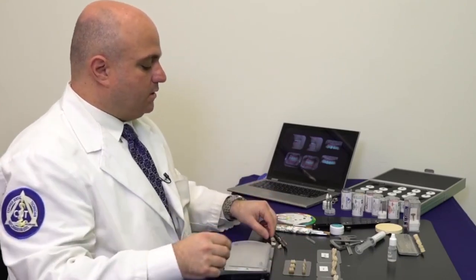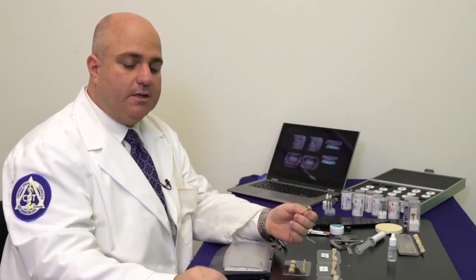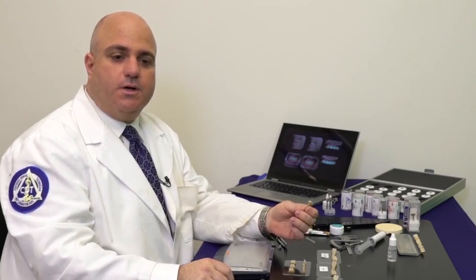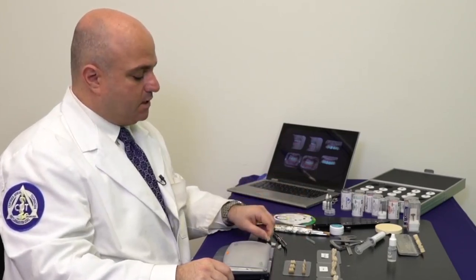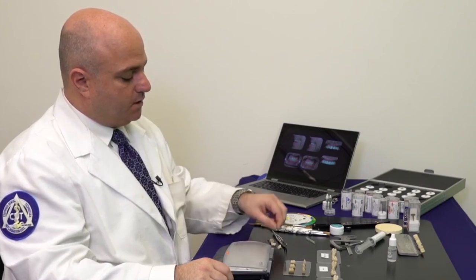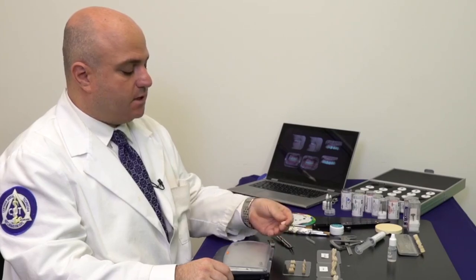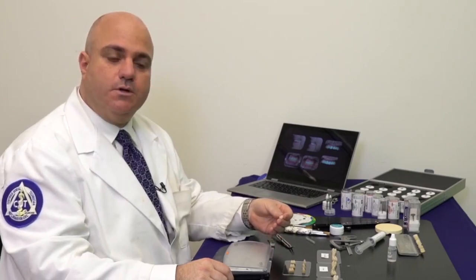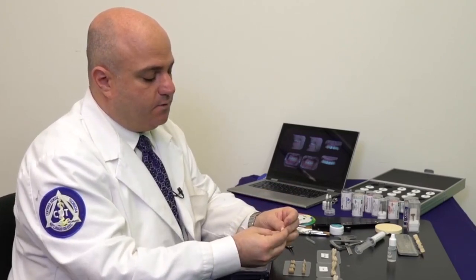What I always do is also use what's called a stump die. Depending on whether you're doing a lithium disilicate or a translucent zirconia, the underlying tooth structure is truly going to affect the way your final shade comes out. Here I have both for the molar, which is what I'm going to be demonstrating today, as well as for a central. Once I place the stump die, you can really see that it just adds a little warmth to it.